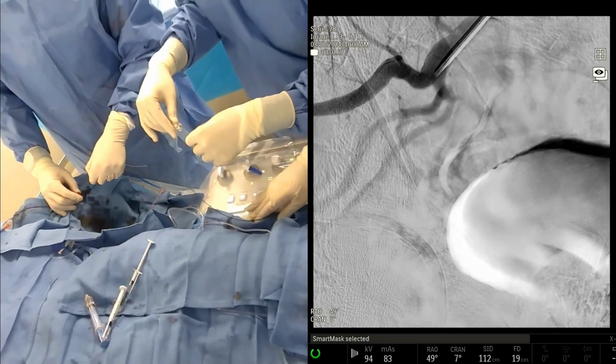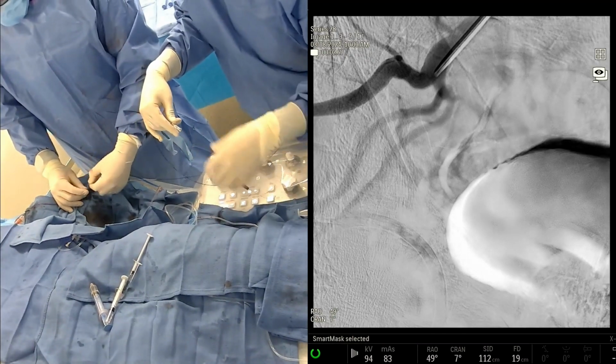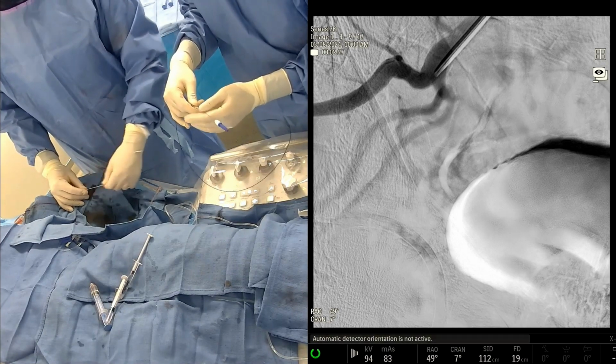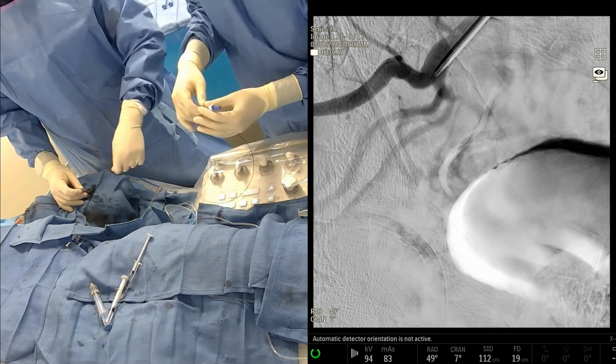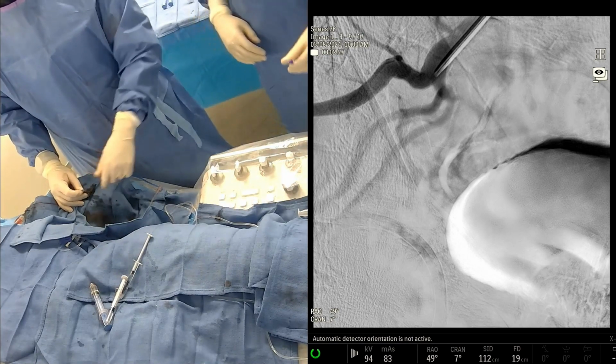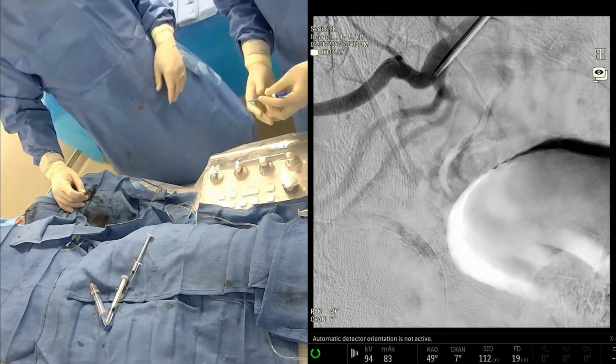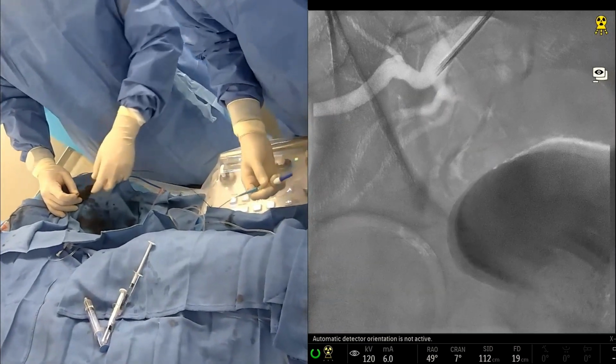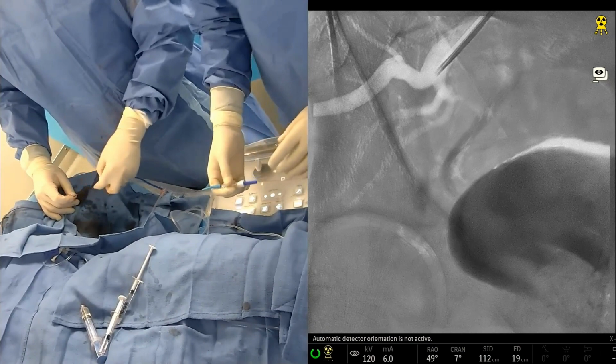We could also try a different catheter. The angle on this is good, but it's a burn tip. I sometimes like a swan tip, which is only really available in the Direction, not the True Select. And the Direction is a bigger catheter, which I don't love. So we'll try with this for a few minutes.